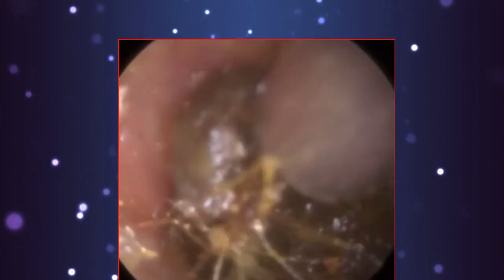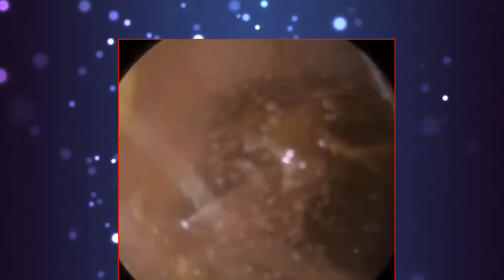So once the ear canal narrows, it widens again. So the wax beyond the isthmus is larger than the narrowing. So we're trying to bring through a large object through a narrow aperture, which is always difficult. And I was just lifting it off the back canal wall. I could feel a bit of resistance. Again, this is like chewing gum now. So I've just put a bit of olive oil drops in.